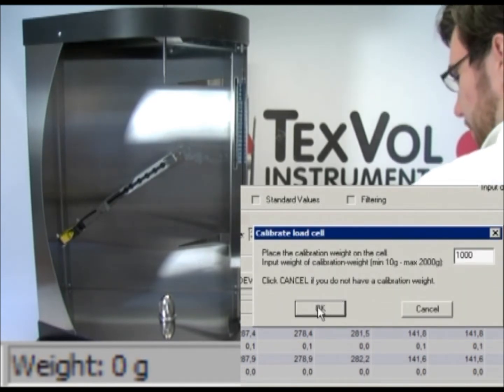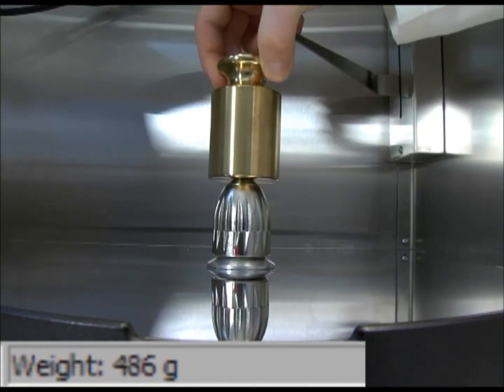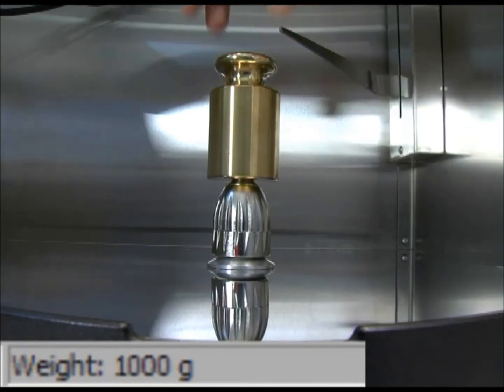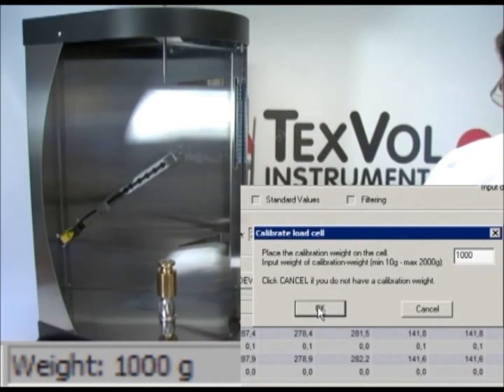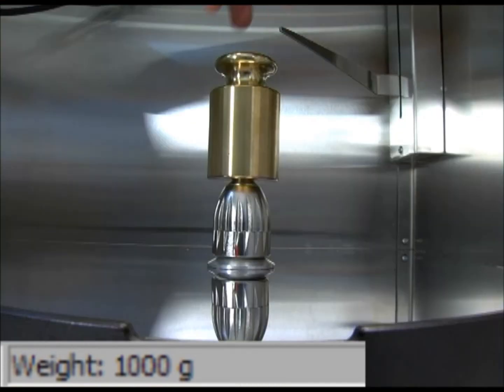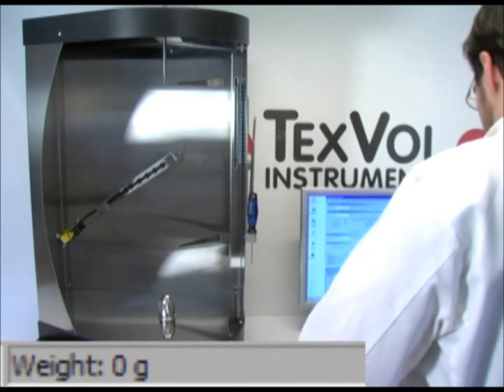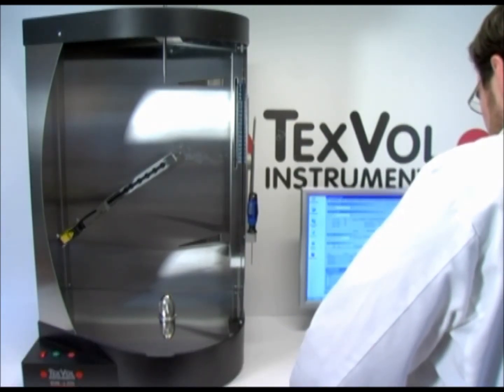Remove all objects such as support shafts and attachments from the chuck and click OK. Input the weight of the calibration weight. Place the calibration weight carefully on the chuck. Make sure the chuck is open enough so that the weight can stand securely, and click OK. Click OK once the calibration is successful. Note: if a calibration has been made without the correct calibration weight, the weight readings will be incorrect.